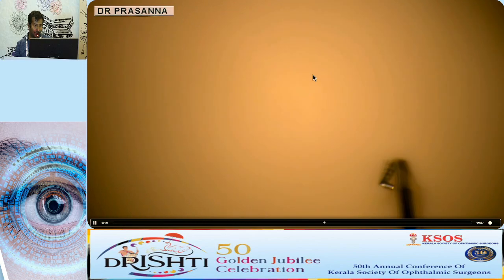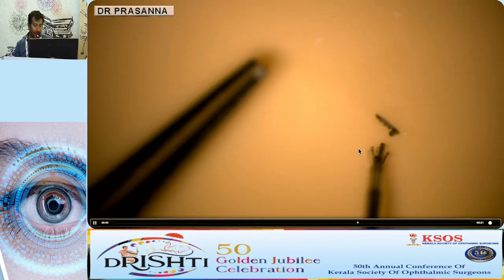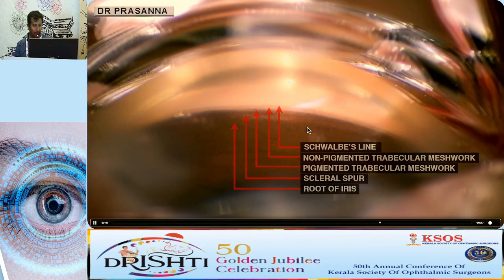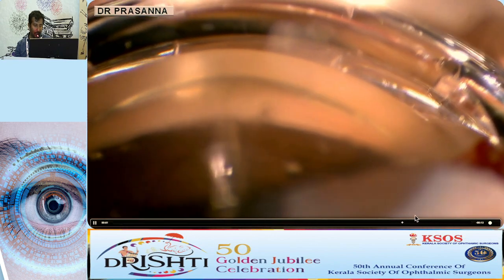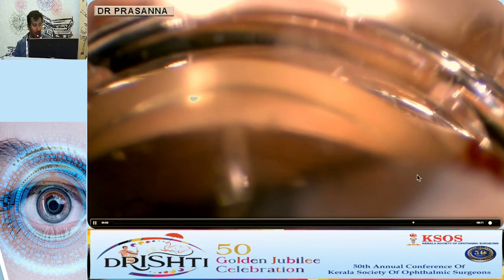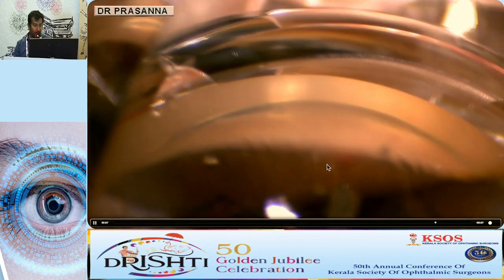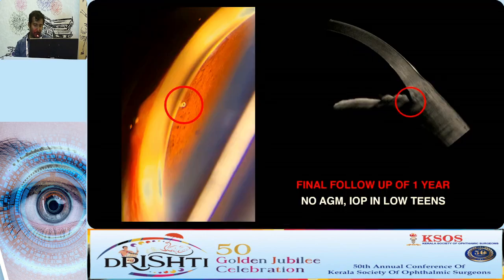If you lose the stent, with great difficulty you can actually put it back into the injector, because the stent has to be put in with the injector. You cannot just grab it with any other instrument and inject it. So don't lose the stent. If you lose it, it is quite difficult, but you can put it back into the injector and use it.